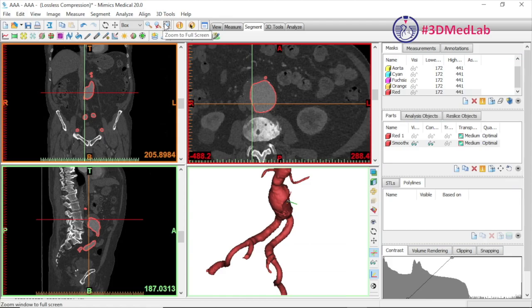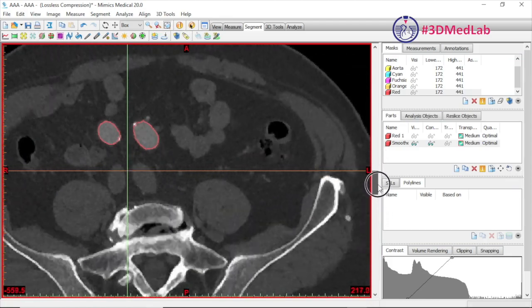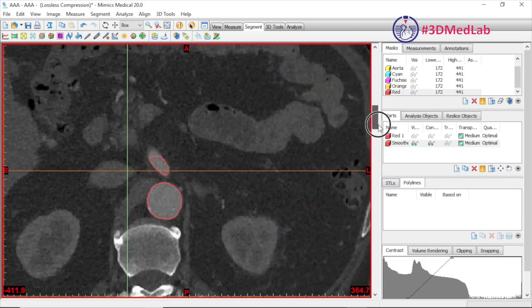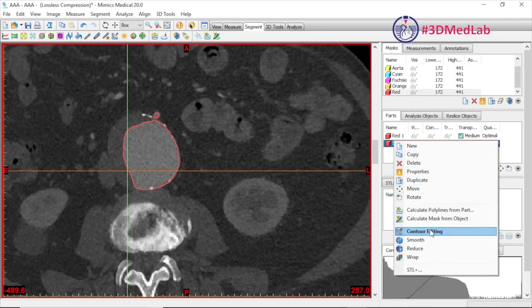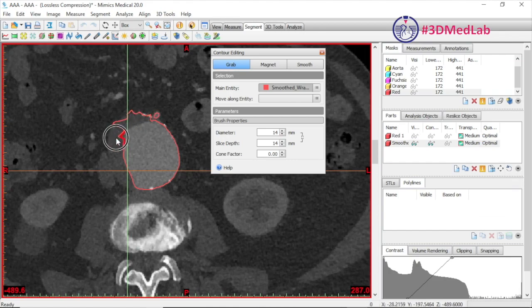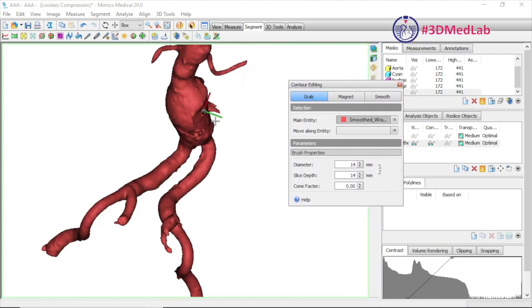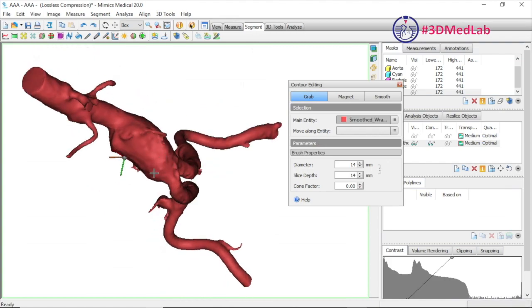Having created our wrapped and smooth model, we'll go back and check the contour lines to make sure it matches the anatomy. I'm pretty happy with that. If you're not happy, you can use the contour edit tool — right-click or choose it from the menu. Choose the model you want to edit and then you can push and pull. Once you're happy with the contour edits you can preview your changes in the 3D model. We can spin it around — you can see we've made it all spiky, which I don't particularly like, so I'm going to undo all those changes.